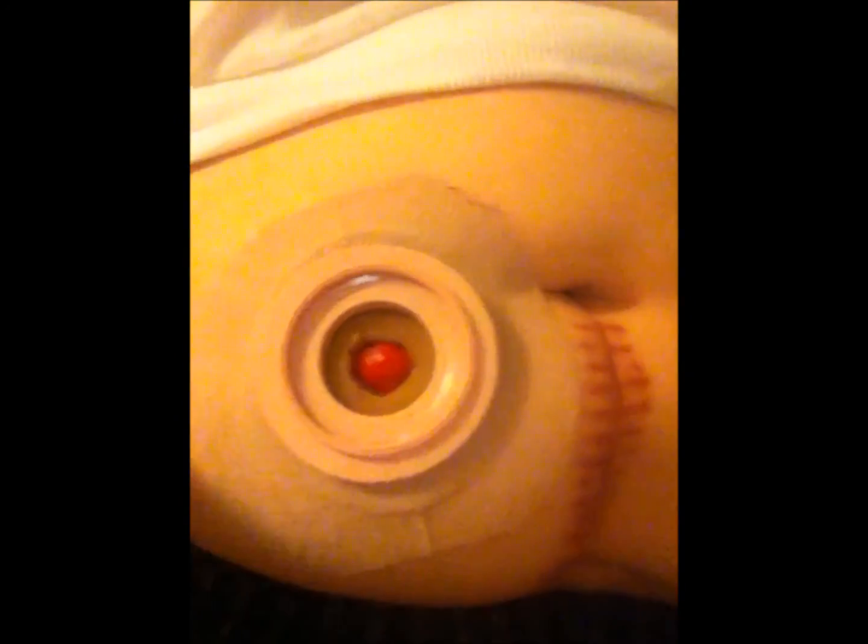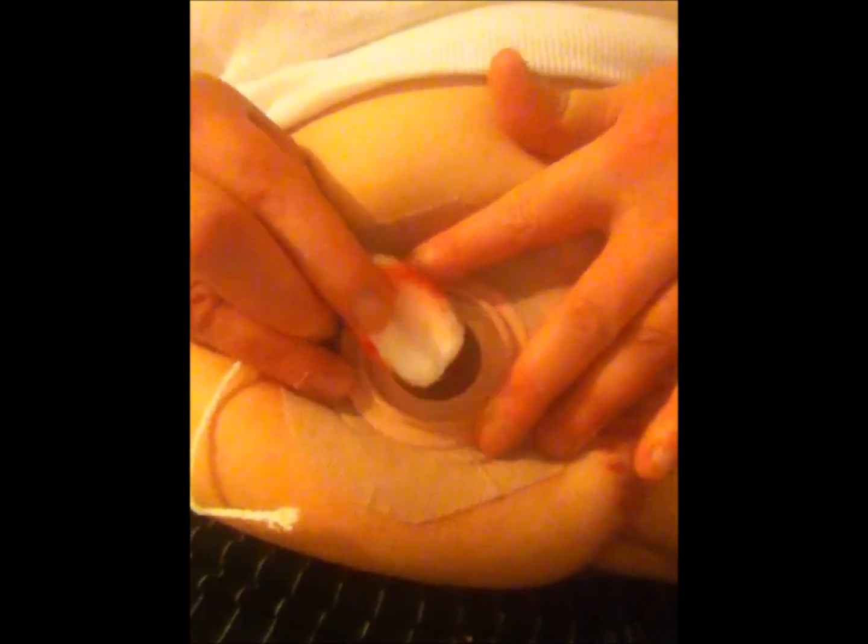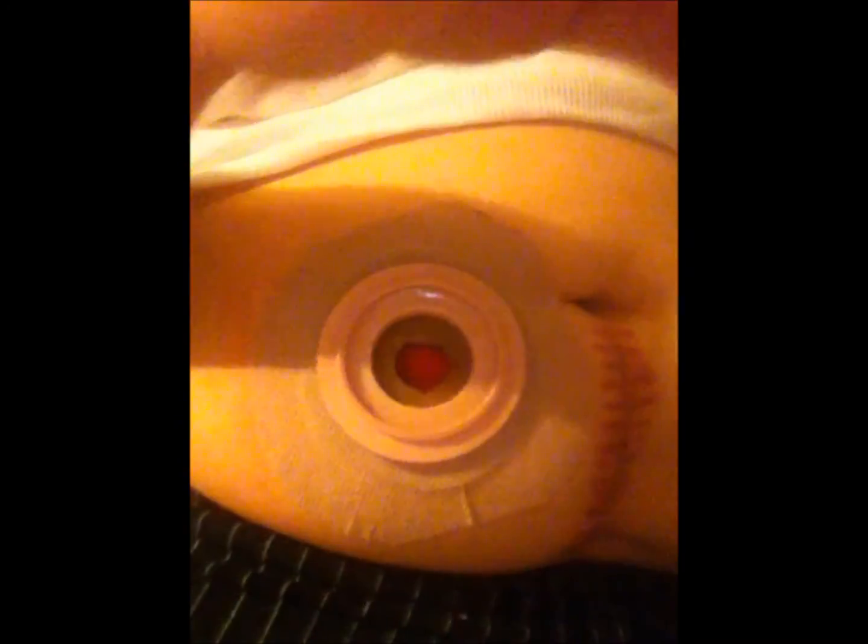And then the very last stage is, this is just like Tupperware. You can see it has a ring, just like Tupperware, and on my bag is the other part of the Tupperware. This here is for my ostomy belt to attach, and the ostomy belt's job is to hold my belly in really, really tight like that, so my ostomy will stick out as far as possible to give me the cleanest urinary diversion. So now, very last stage, I'm going to take this bag, I'm going to turn it around, and just like Tupperware, I'm going to snap it on, and you can hear it snap. And I make sure that it's on really well. And I have a very clean bag, and I have a very clean ostomy site, and I'm ready to go.